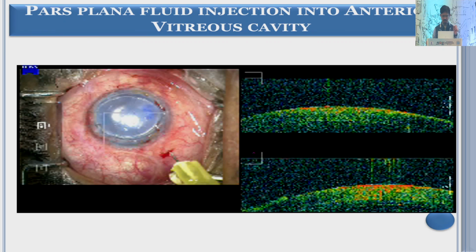And the last thing that I would like to mention here is that, as I was telling, all these eyes are hypotonic. So many times you inject air, even if there is an IOL, SFIOL has been done, because of the hypotonic, vitrectomized eyes, there's a tendency of air to go posteriorly. There's a tendency of air to push the iris rather than push the donor lenticule.